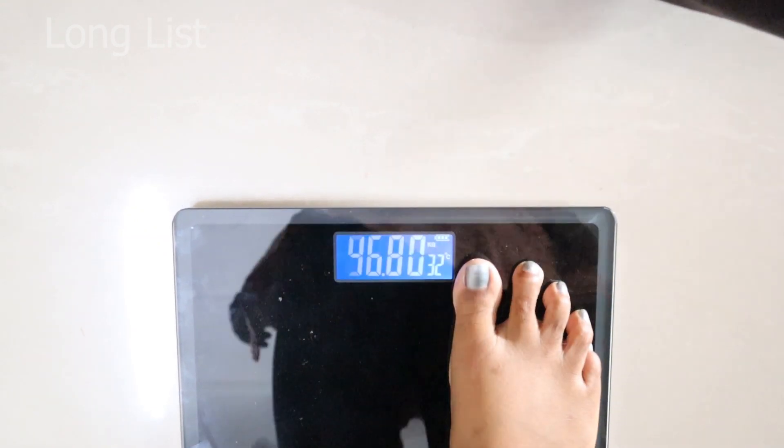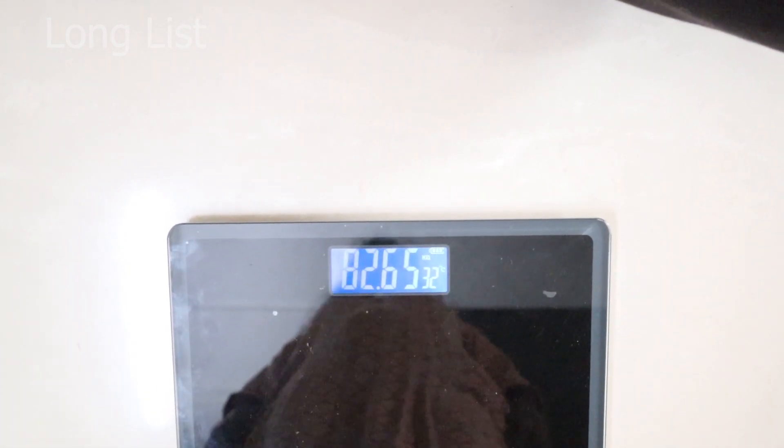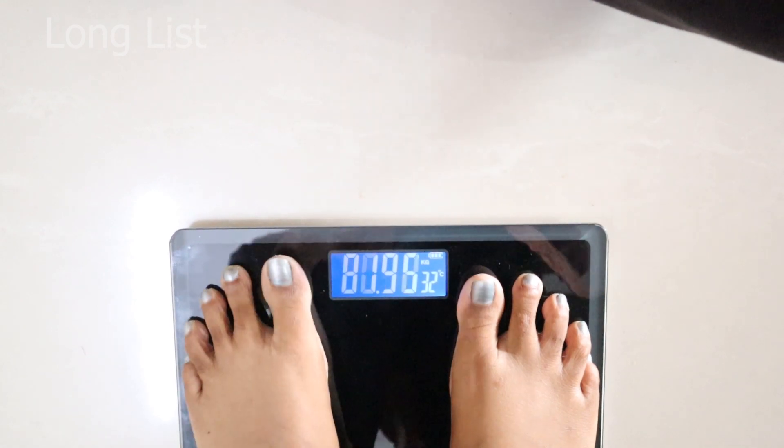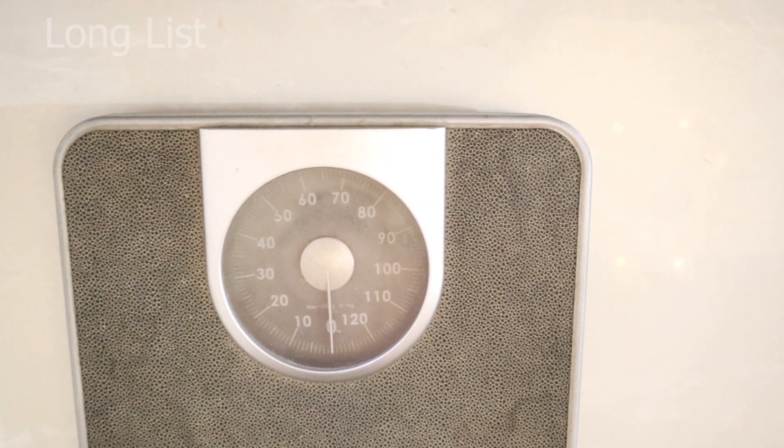Round 2: 82.65 kg. Round 3: 82.65 kg. The reading is consistent, confirming the capacity and accuracy.